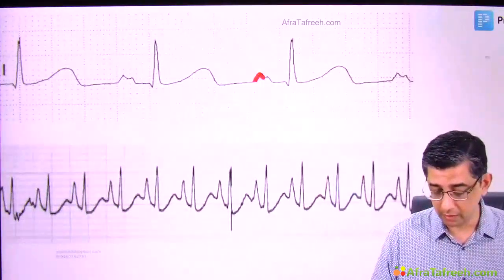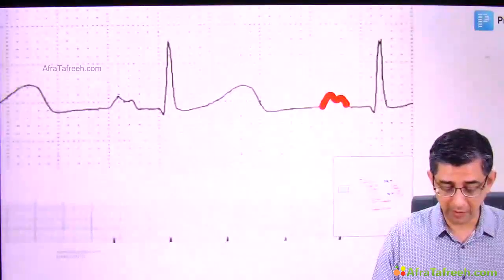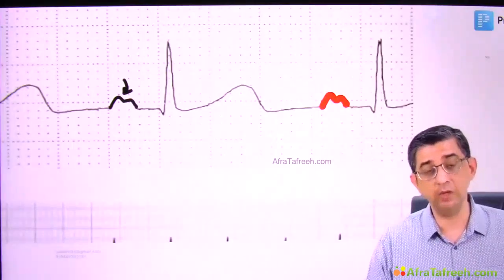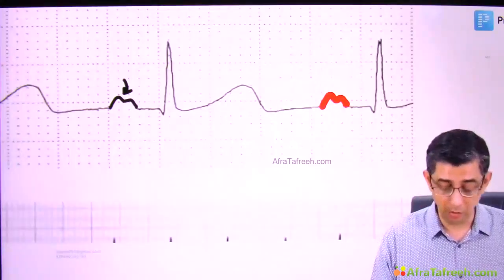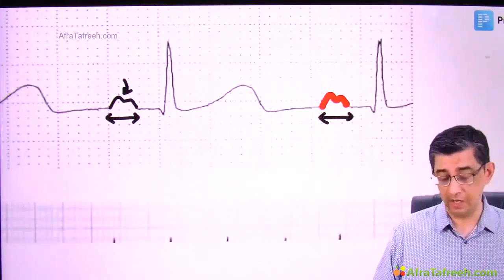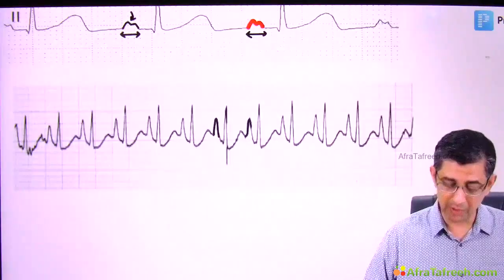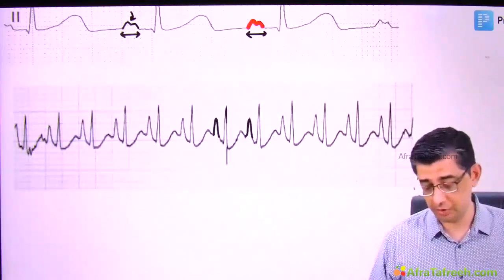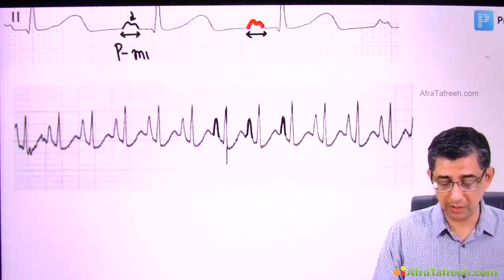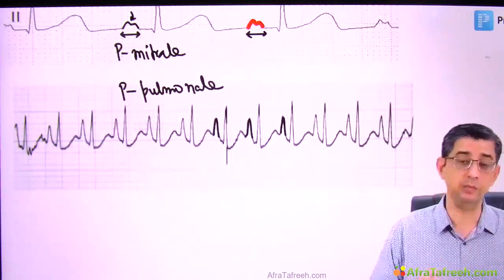You can notice a slight, I would say, bifid appearance of the P wave coming up. Actually, this is a classical textbook image, so fine, you can see the notch per se. But what I want to highlight here is that lots of times in the exam, all you will notice is that the duration component is affected in this particular case. At the same time, with the P wave amplitude, it's rather a spiked P wave. You can notice the spike occurring in the P wave, because the height is relatively more. So the superior representation that I made before you is for P mitral and the inferior one is for P pulmonale, and these are two abnormalities that must always be looked at.